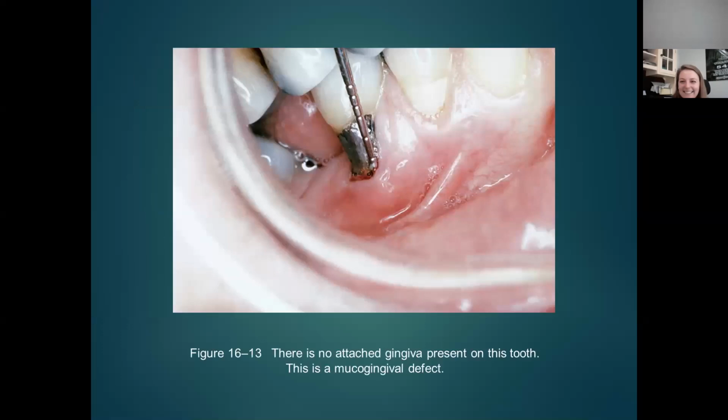Here, you can see that there's visible recession. There's an amalgam restoration, which isn't being placed like this anymore because it's unsightly. But the nice thing about amalgam restorations, especially before composites and isolation were so good, is that their chance of getting recurrent decay was much less than with the bonding techniques.